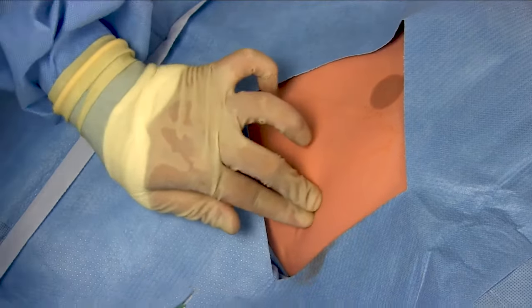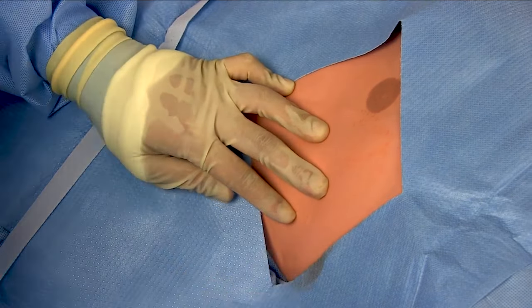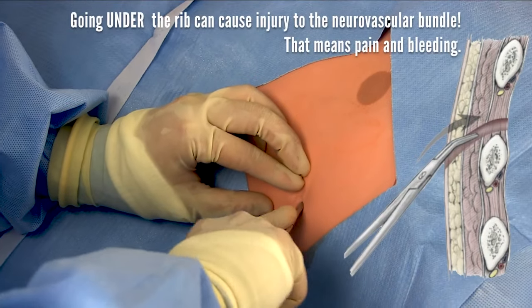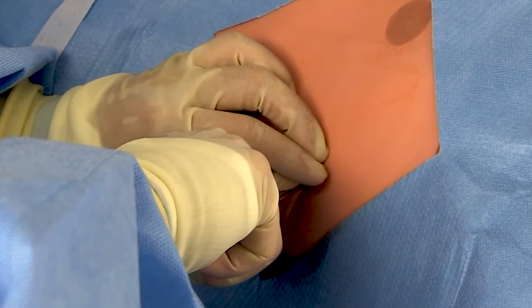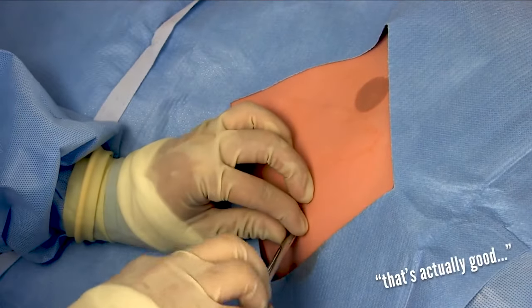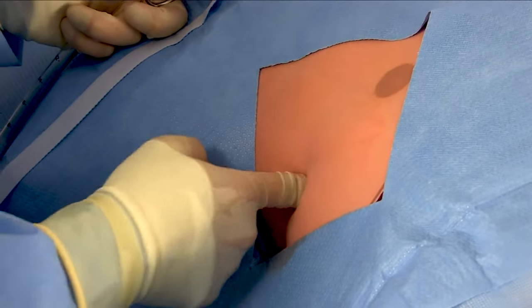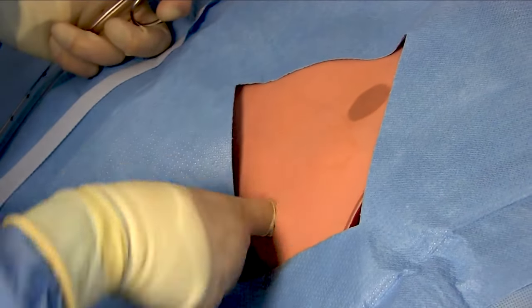Now we're ready to cut. Feel again for that intercostal space, make sure your trajectory is going to take you over the rib, then make that incision — two to three centimeters transversely just over that rib. Pick up that second pair of Kelly's and insert it into the incision. Apply firm but steady pressure down toward the chest wall over that rib until you feel you pop through the parietal pleura. Notice I'm holding the Kelly's high on the neck of the clamp and bracing it with my left hand — that will help prevent you from diving the clamp too deep into the lung.